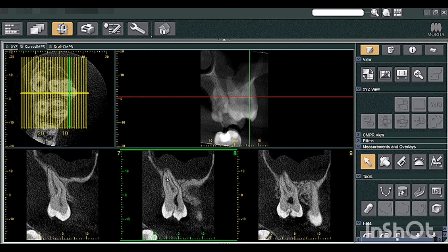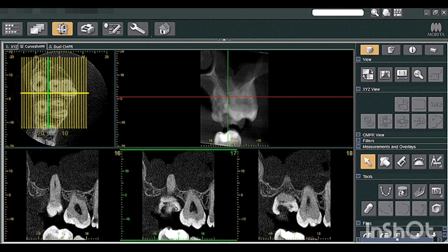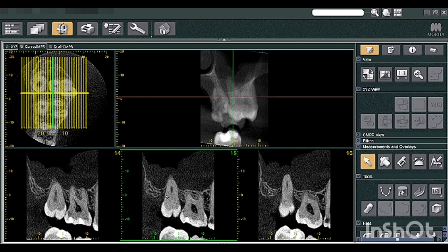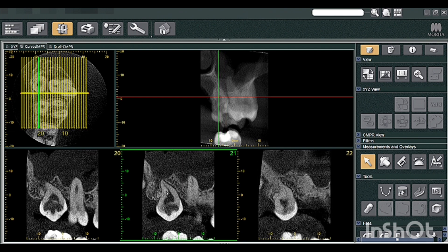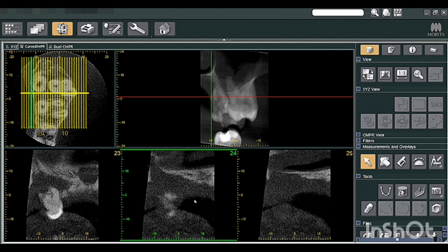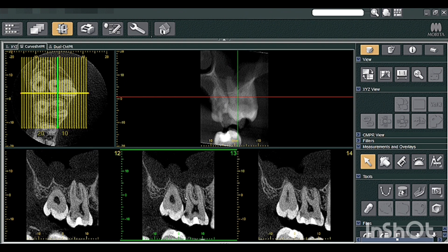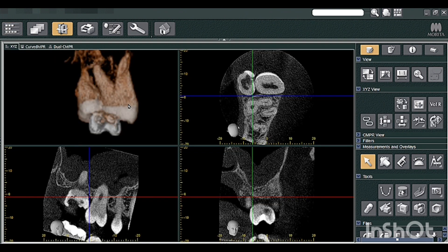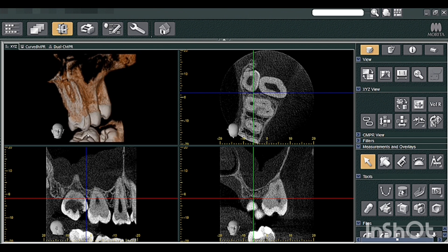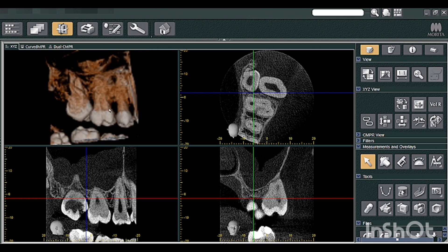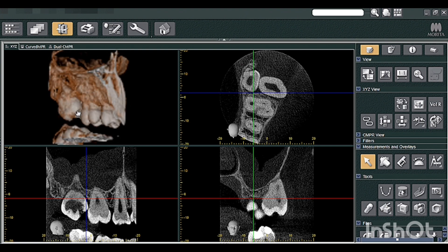You can see the buccal roots of 27 going internally — the palatal root of 27. Going further internally, tooth 28 has started — grossly decayed — and you can see how the roots are in contact with the sinus. This will help the clinician during the extraction procedure so that the oral surgeon can remove it safely. So this was everything about impacted tooth 28 — or the impacted third molar — which is palatally placed. It may give an appearance of a supernumerary tooth, but I feel it is more likely an impacted third molar that is palatally placed.